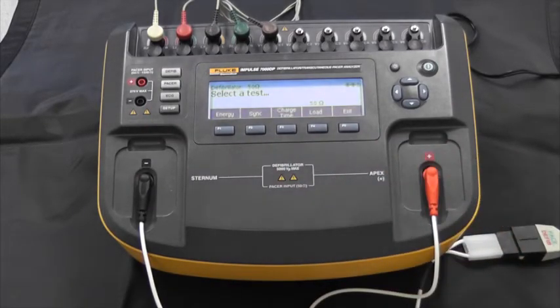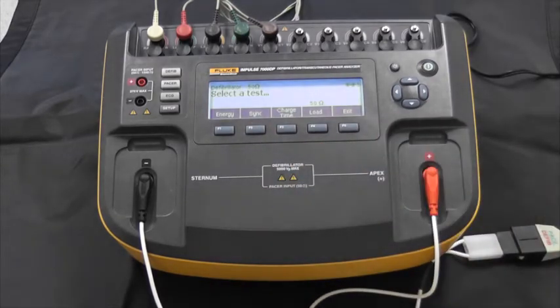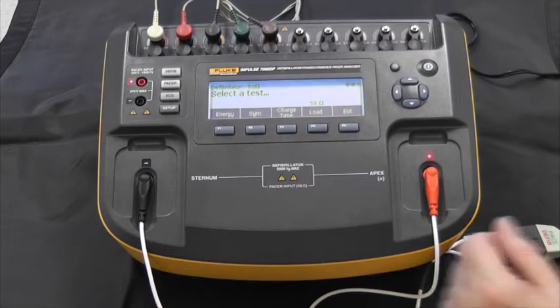Once we have selected defib as the category we want to test, we have different kinds of tests available: energy, synchronization time, and charge time tests. We can also select a load if we have the 7010 external load accessory. Otherwise, as you can see here, we're selecting the internal 50 ohm load.